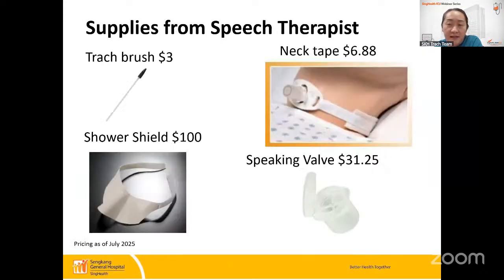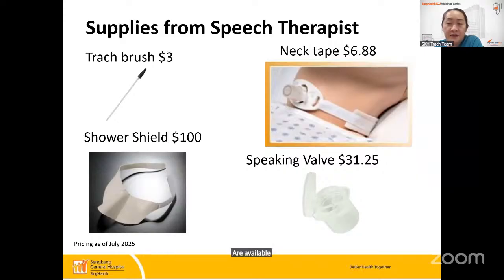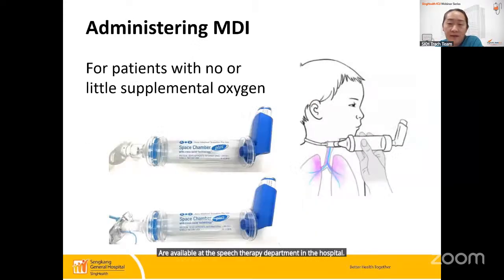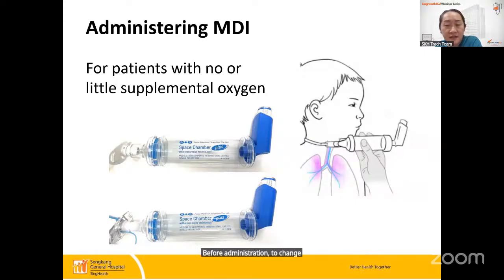The supplies and consumables are available at the speech therapy department in the hospital. MDI can be delivered via an inhaler spacer for patients with no or little supplementary oxygen. Before administration, change to a non-fenestrated inner cannula if applicable.